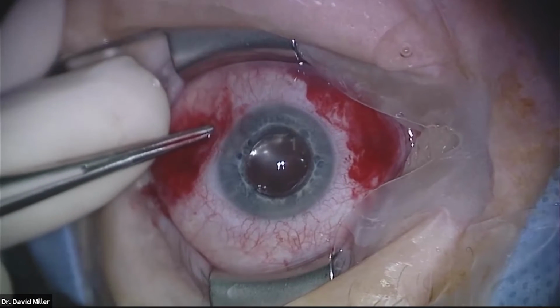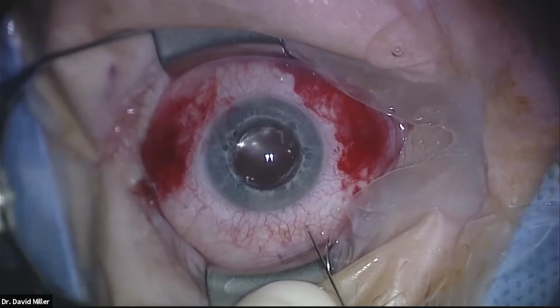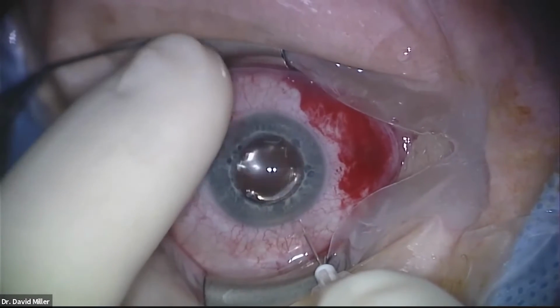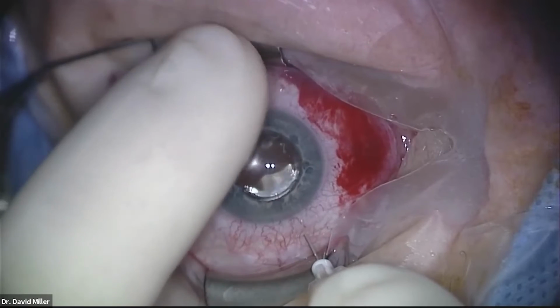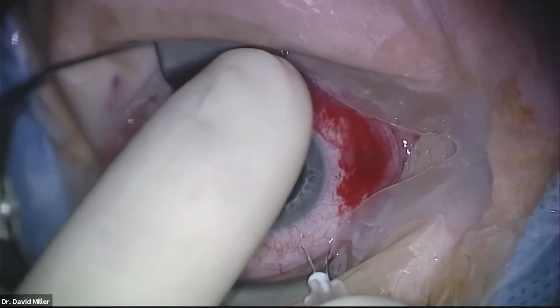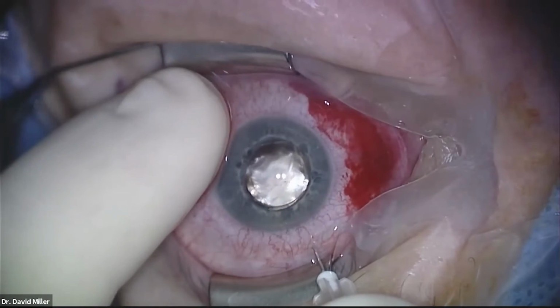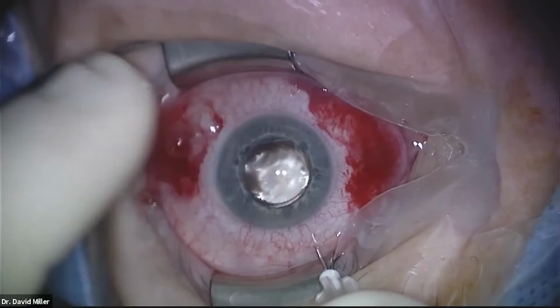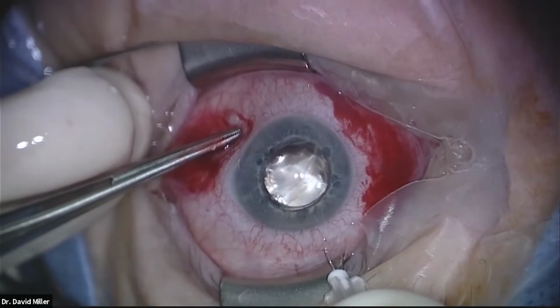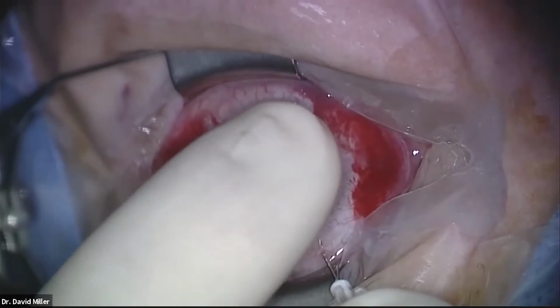And I'm going to press this one flat yet too. So, little needle here, hooked up to the same syringe of mixed gas. And go ahead. Typically I use my finger for intraocular pressure. Keep going, keep going. Yep, I gotcha. Probably right there. Keep going. Got a Q-tip there? There you go, you're fine.